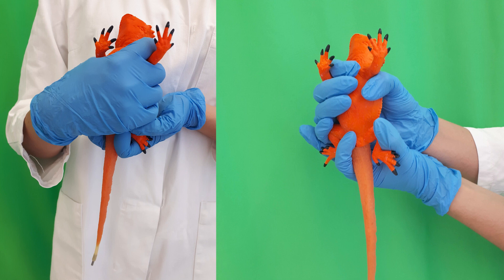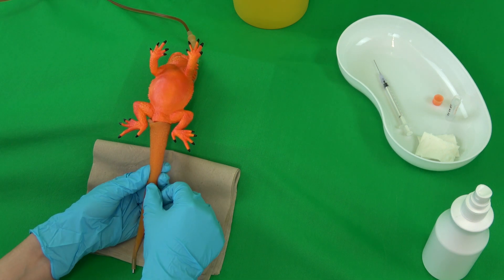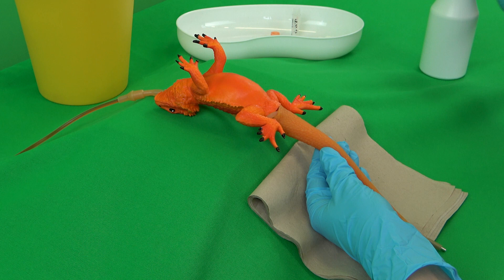The bearded dragon is then fixated by an assistant. To achieve this, place one hand behind the patient's head while grasping the pelvic region with the other. This allows a careful fixation of the hind limbs dorsal to the tail. The patient's tail can then be held between the thumb and index or middle finger of the non-dominant hand, and pulled towards oneself and slightly down.